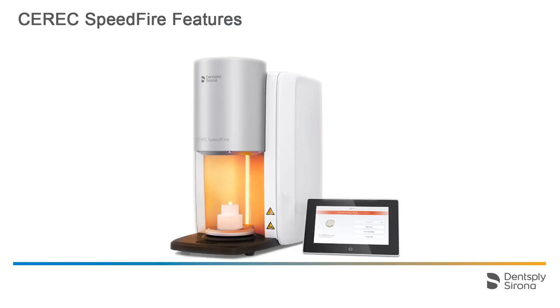CEREC Speedfire is a compact and fast combination furnace that offers sintering, glazing, and crystallization of glass ceramics and zirconium oxides. The firing chamber offers space for up to three single tooth crowns or one 3-unit bridge.